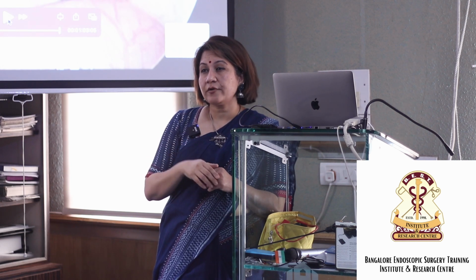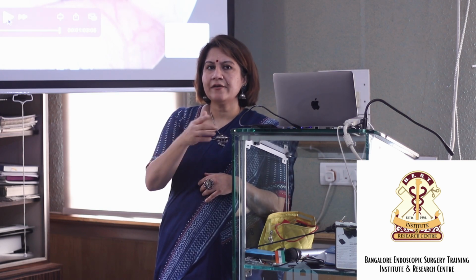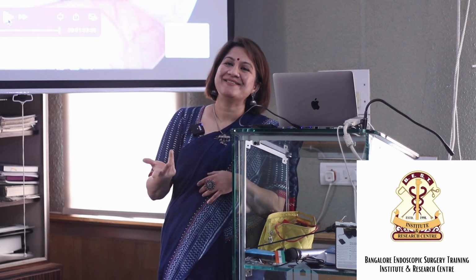It can't damage too much. Anyway, you have to put a laparoscope beforehand, so you know nothing is adherent there. You can't badly damage anything. Even if you perforate a bowel with this guide wire, I don't think anything happens. It's too thin for it to cause any damage.